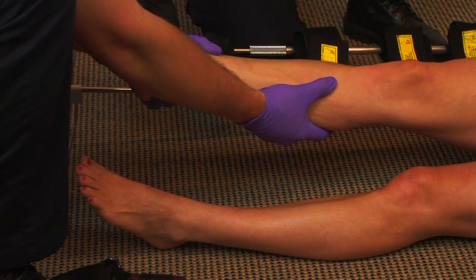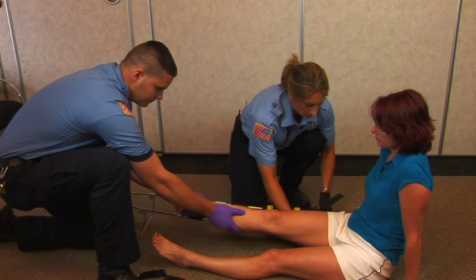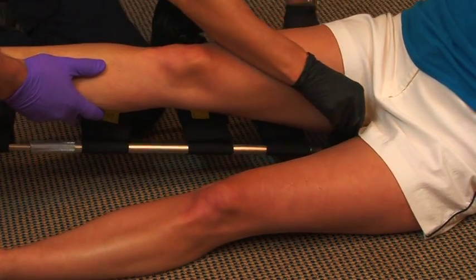The traction splint should be fitted on the uninjured leg and brought over to the injured leg. Slip the traction splint underneath the patient's hip at the ischial tuberosity.